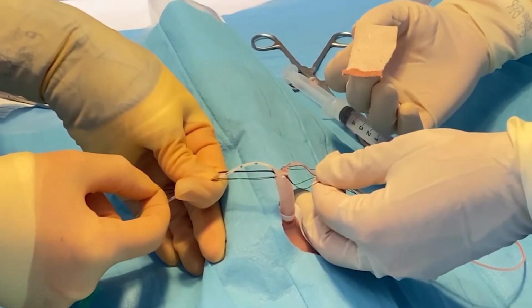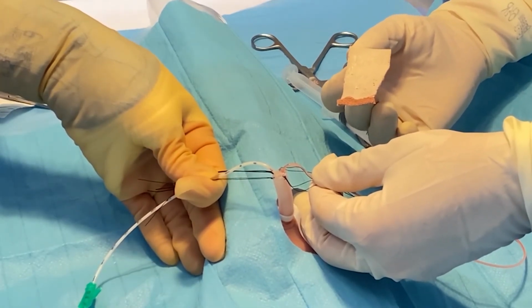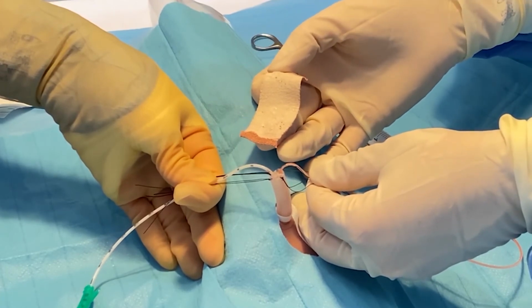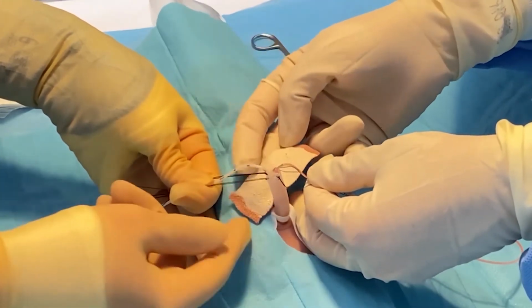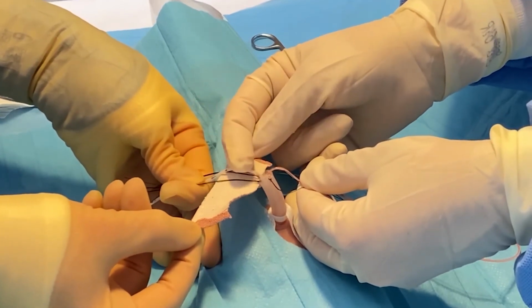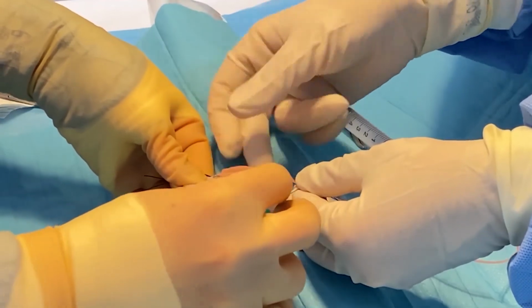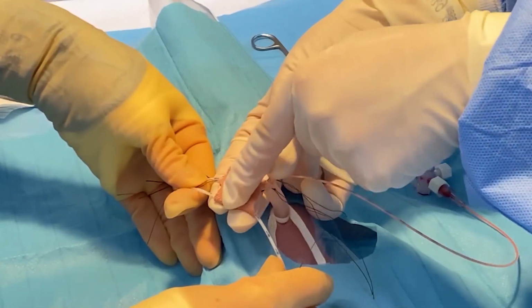So once you've inserted your 4 knotted sutures, 2 for each catheter, you then want to secure it with a piece of elastoplast. So with this, I find it's easier if you turn over the corners just so it doesn't stick to your gloves. Then you want to place the sticky tape underneath with the help of your assistant. Ensure that the lines are all held taut, and then you want to fold it over close to the cord, and then you want to bend your catheter line down and then fold again to secure it like so.